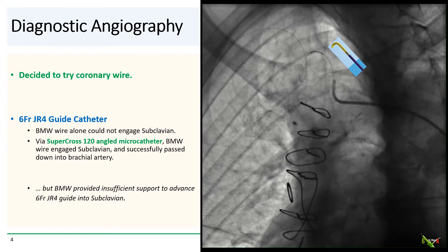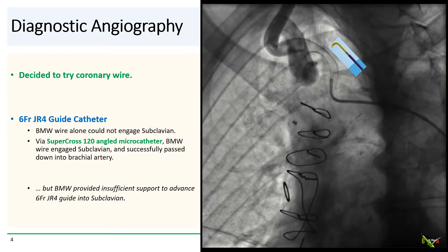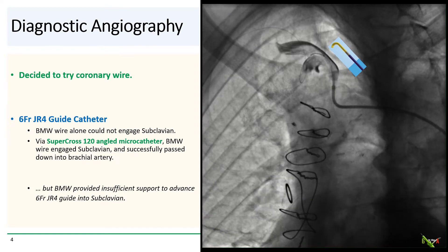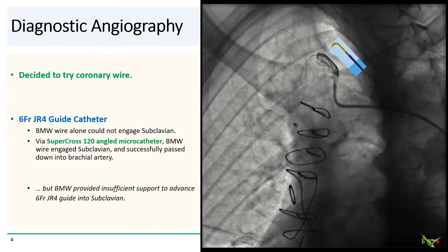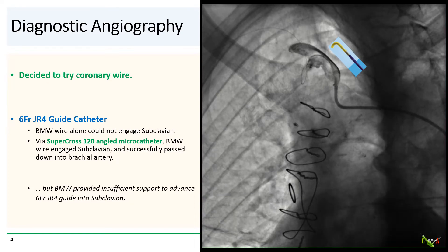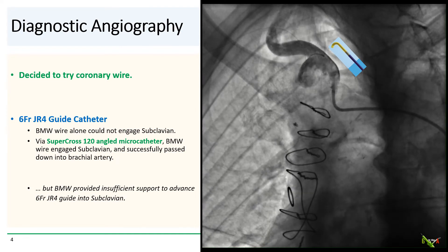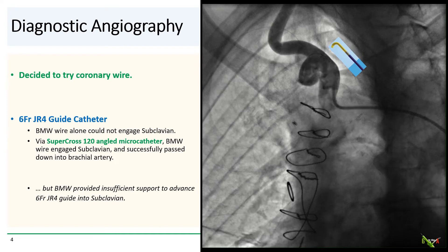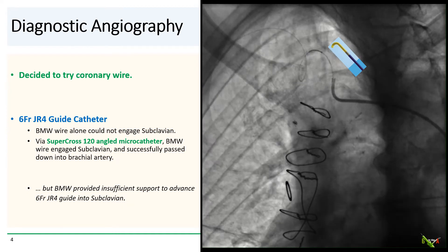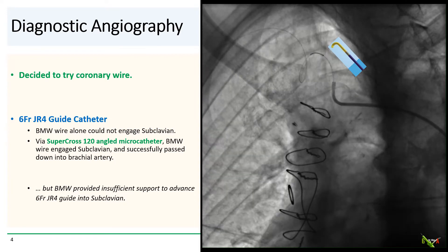We were about to stop, but one of our very experienced senior techs suggested trying an angled microcatheter — an interesting idea. Angled microcatheters are usually used to engage difficult coronary side branches. So we reached for a Supercross 120 microcatheter, and that actually successfully engaged the mouth of the subclavian and provided enough backup for a BMW to navigate around all of the tortuosity, all the way into the brachial artery, even with the guide kicked back.